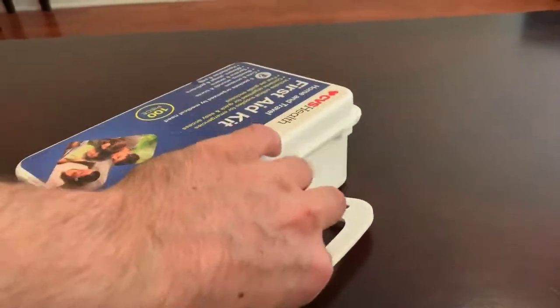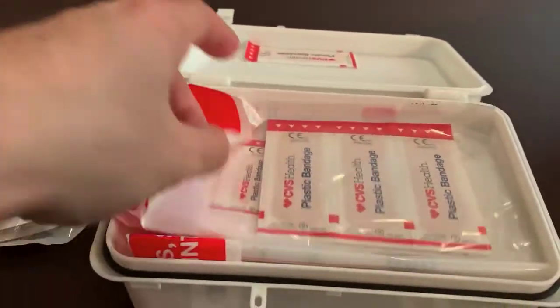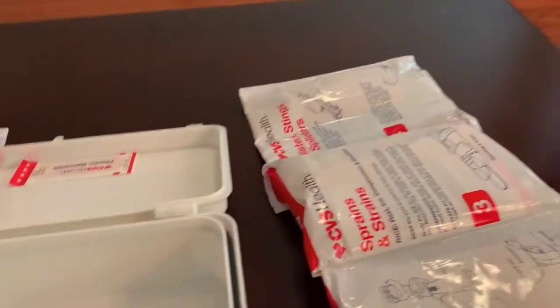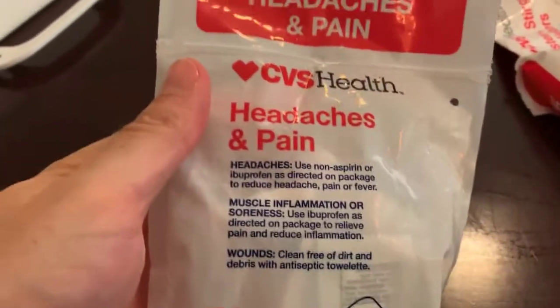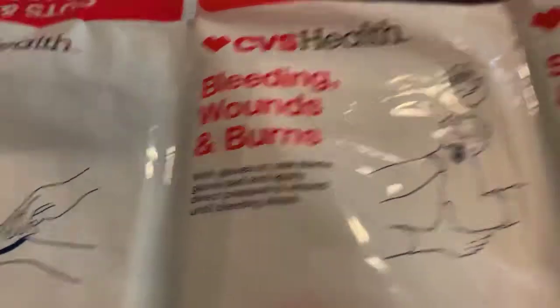Let's take a look. There's a lot of cool stuff inside here. You have your band-aids, headaches and pain, antiseptic towels — that's for cuts and scrapes, bleeding wounds and burns.